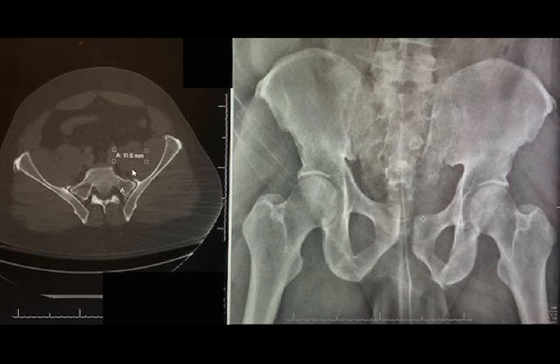So after a while of going back and forth through all the different options, we decided to do an exam under anesthesia, to see if this joint widens anymore with abduction and external rotation, which I suspected it would, just based on this one static image. I suspected that I would be able to reduce it by taping the legs together and get some of that symphysis back, and therefore doing an SI screw would be very useful.